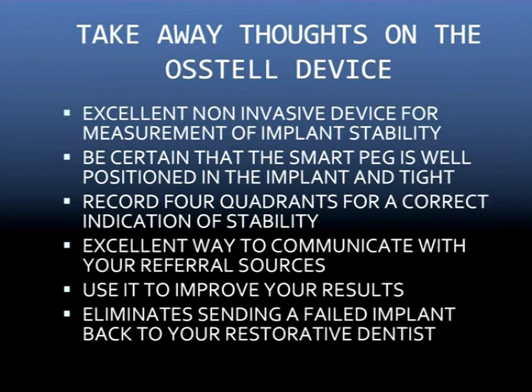So in closing, what are some takeaway thoughts that we can have with this device? I've integrated it into my practice so it's a completely, totally important part of the practice. Every patient gets Osstell readings in all 4 quadrants. And we can see that it's an excellent, non-invasive device for measurement of implant stability. And I emphasize non-invasive because a lot of my colleagues in Portland, Oregon use the reverse torque technique where they literally try to unscrew the implant before they send the patient back to the restorative dentist.